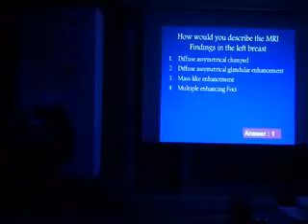One further point that I really want to emphasize here: from what I see in the market, people will not stick to the proper dose of intravenous contrast. And if you don't give the proper dose of intravenous contrast, don't expect that you will have good results. All that has been written in the literature only deals with the proper amount of intravenous contrast.